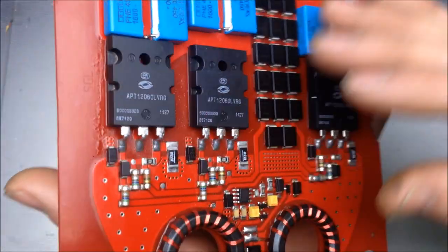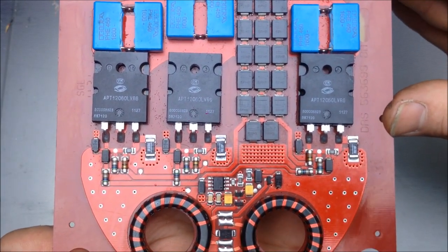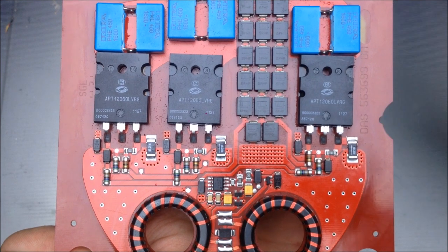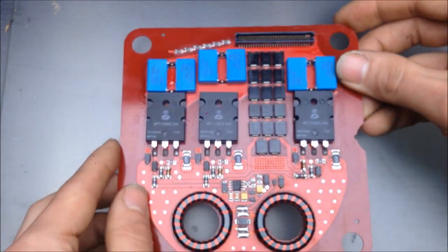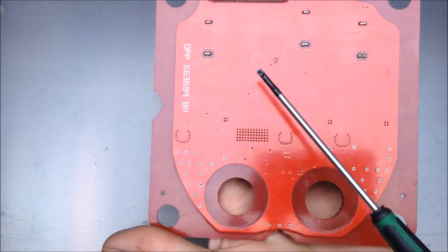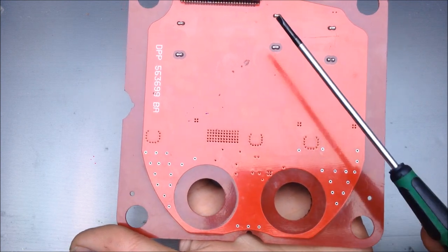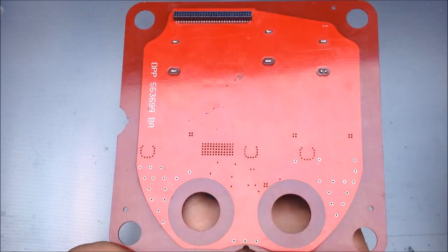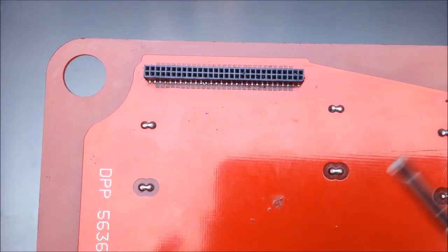This circuit board actually came from an MRI machine, and this is an ingenious piece of hardware engineering. Let's get into how this circuit board works. This side is a common ground plane, and this common ground plane is shared throughout this surface. You can also see the connection for the ground plane on this side of the board here.